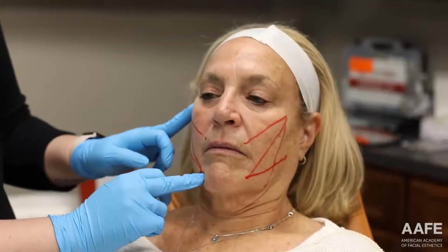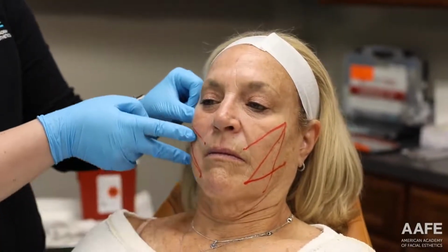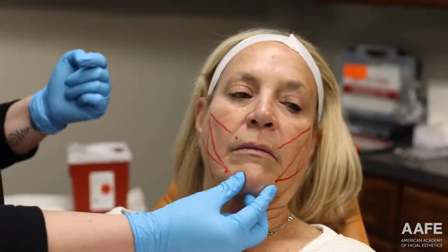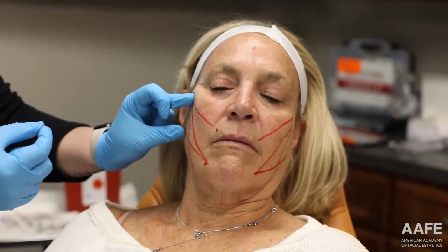We're doing a 3-vector, so this is gonna help pull up her nasolabial fold, her marionette line, and then her jowl. So that is the 3-vector pulling up this way. And then this line down here, if you turn your head that way a smidge, this line right here will help to define her jawline a little bit more. It'll also help with pulling back that marionette line and the jowl as well. So we're doing the 3-vector and the jawline on both sides.